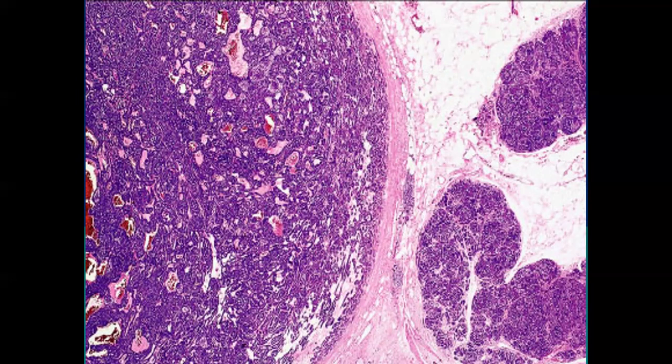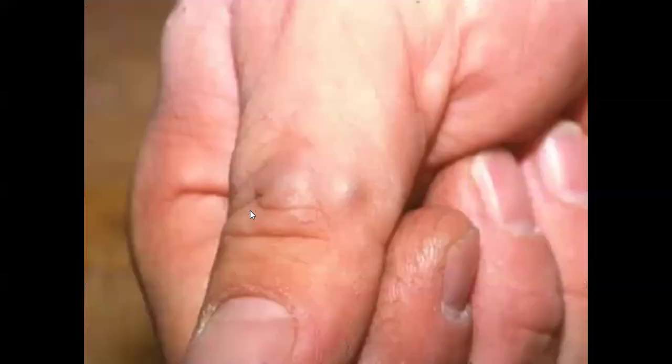This is eccrine spiradenoma, and again, it typically has two populations of cells, cells with dark basaloid nuclei, and the other ones are cells with light-colored vesicular nuclei with cyst-like spaces.